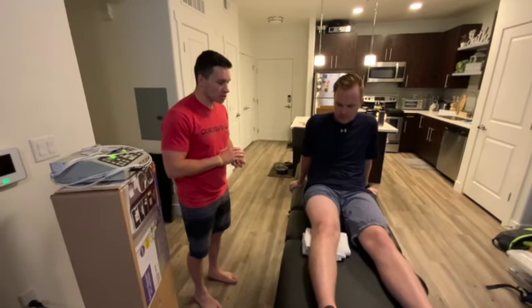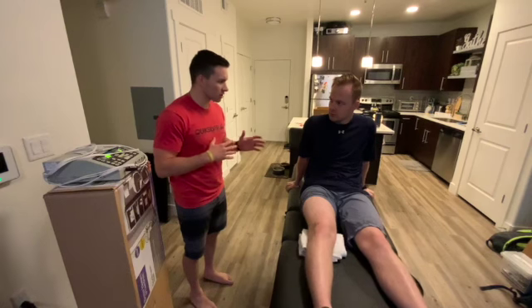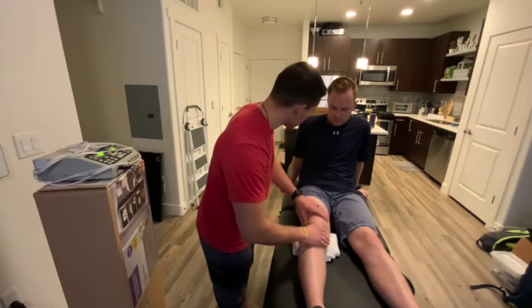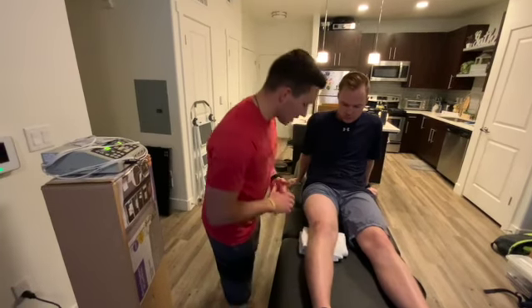Yeah, that's fine. Okay, so first, is it okay if I put my hands on your knee just so I can feel around and make sure that we're getting good sensation to your knee? Mm-hmm. Okay, so I'll just come around, feel around here. You feel my hands on there? Sorry, they're super cold. Yep. Okay, that's fine. Perfect.